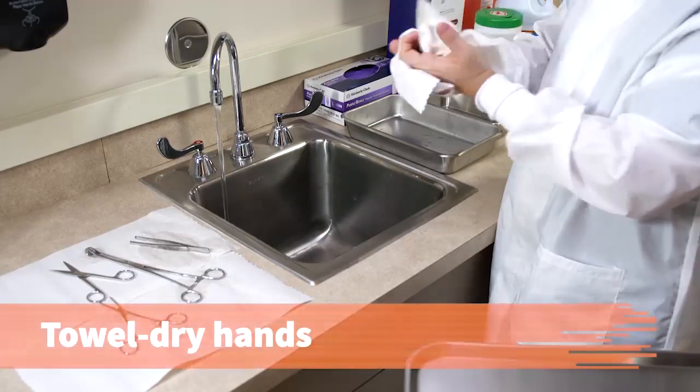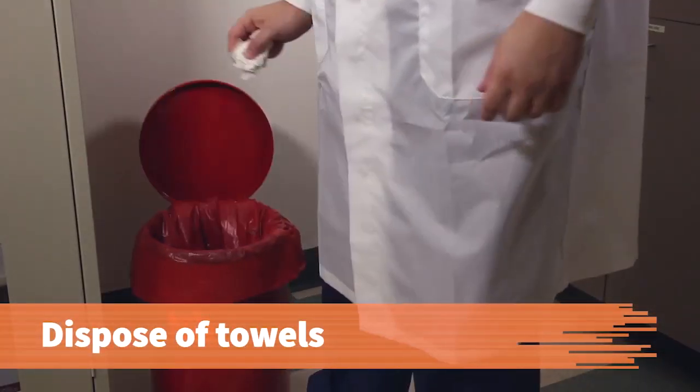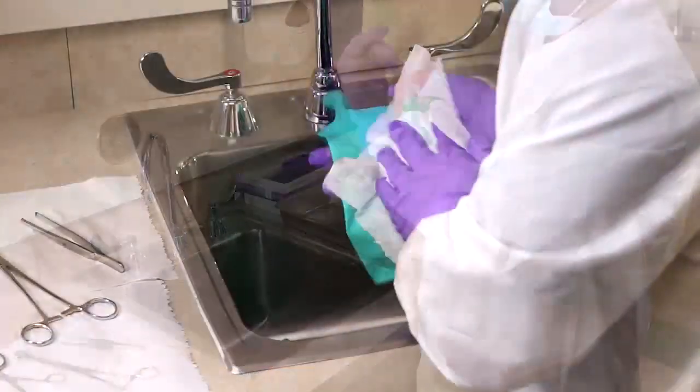To prevent exposure to contaminants, towel dry your hands. Dispose of all towels in a covered biohazard waste container. Put on disposable gloves.